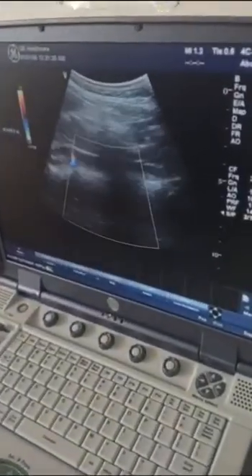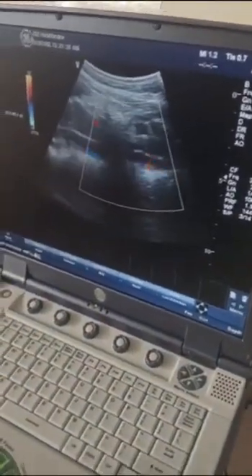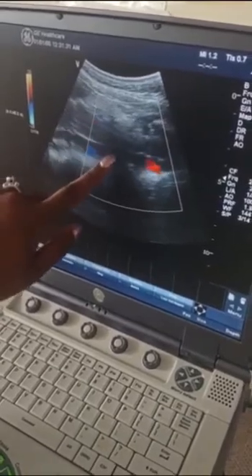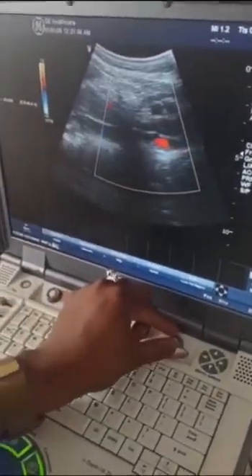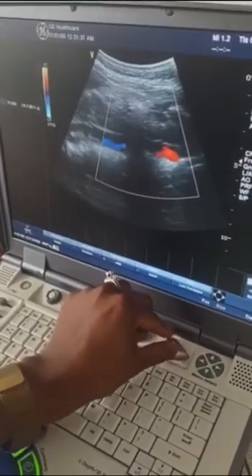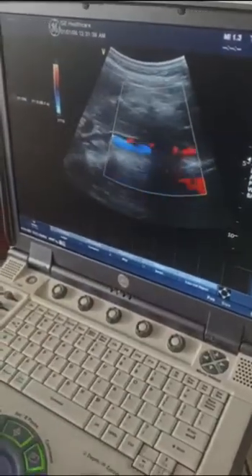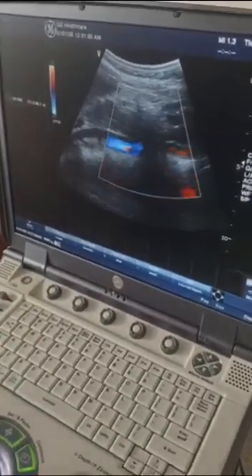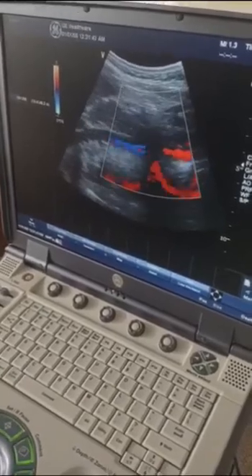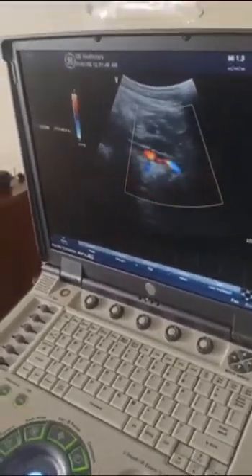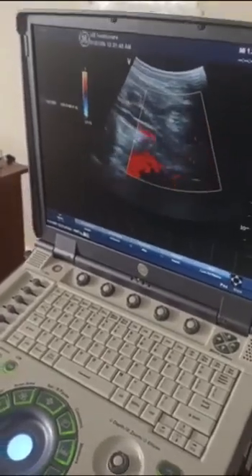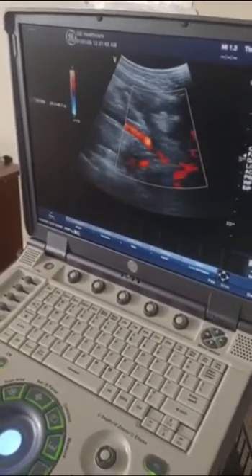As you get to the mid-abdomen, you sometimes will see some gas. You can try to follow it down if you can. You can see the IVC right in this area with the color filling up. I'm going to turn my scale down a little bit to increase the sensitivity of flow, and you can see an improved flow as I turn the color scale down. This is about the mid-abdomen, and I'm going to keep going until I get to the distal segment.